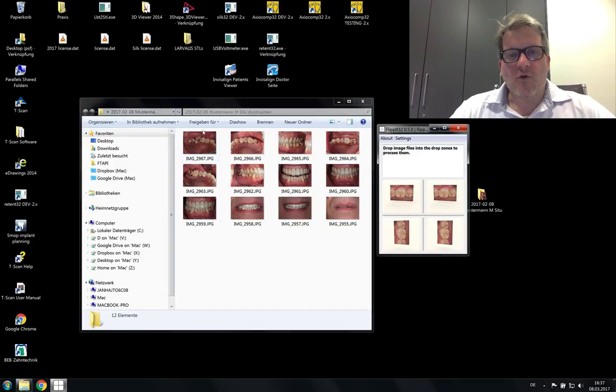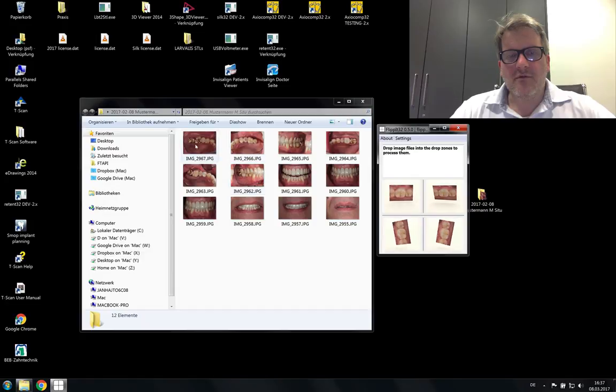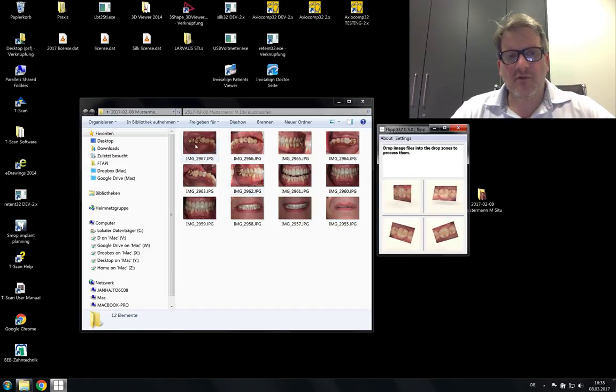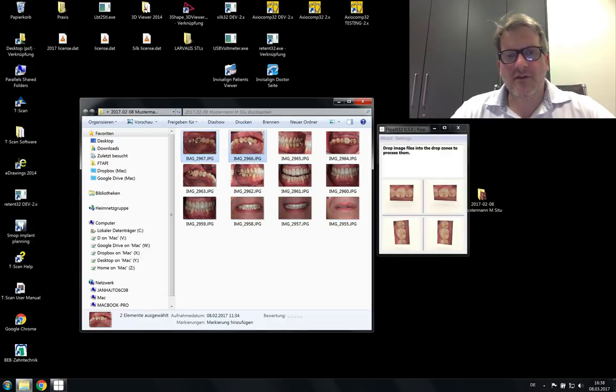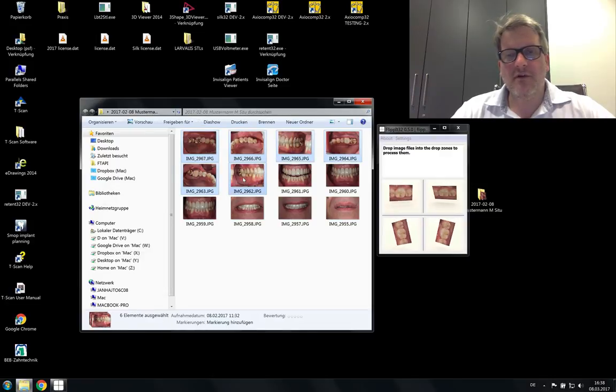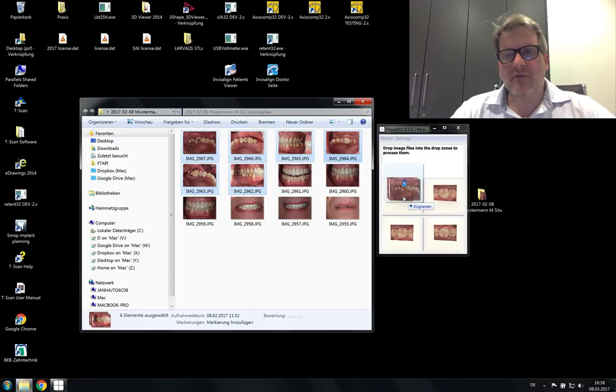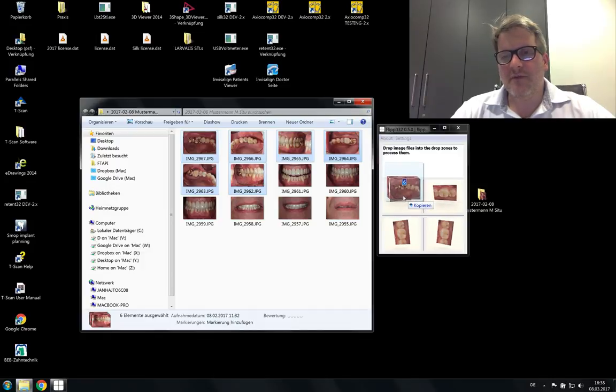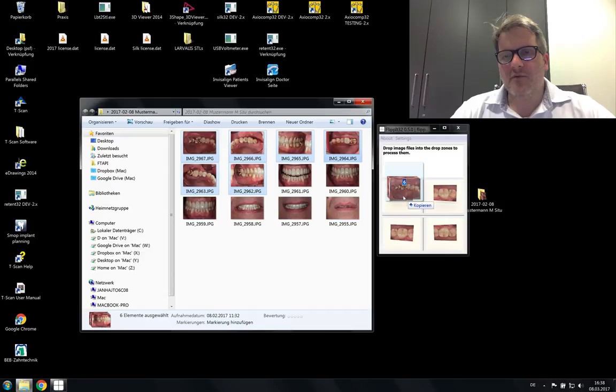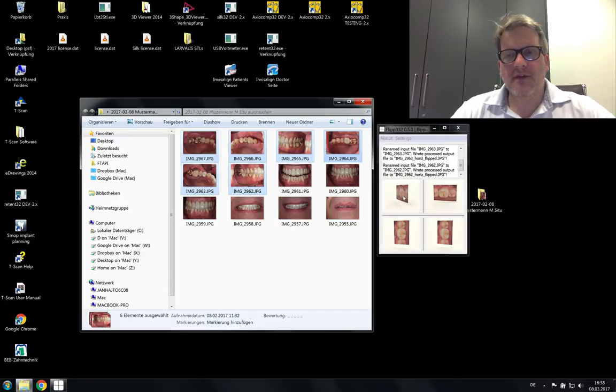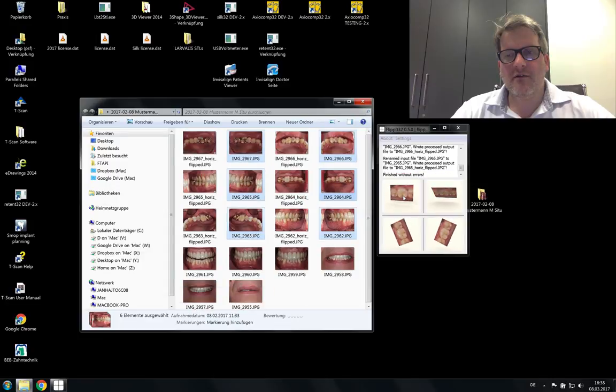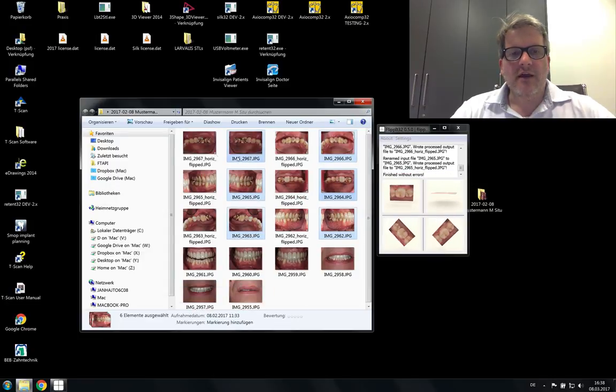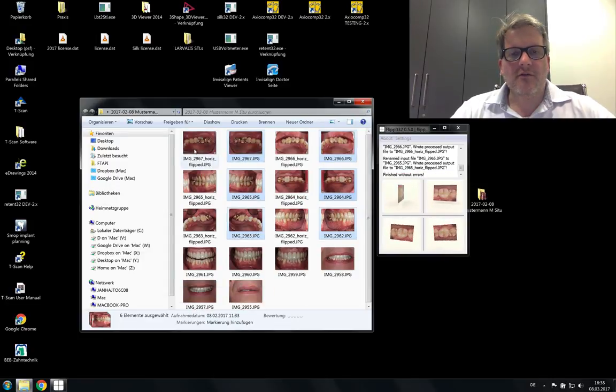So let's see how it works. You have a bunch of pictures, some of them taken with a mirror, some not. So you select those that were taken with a mirror and just drag and drop them together on this one. Then it will un-mirror them. So now it works and it automatically saves it back in the same folder and also renames it.